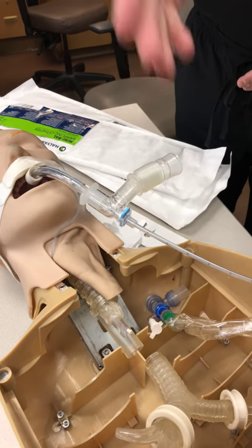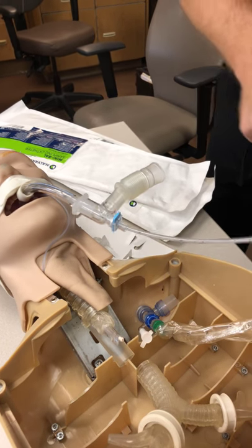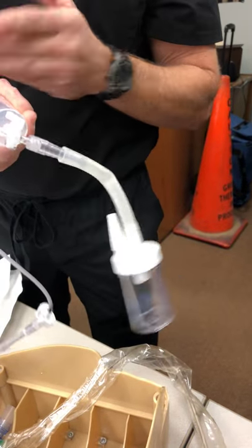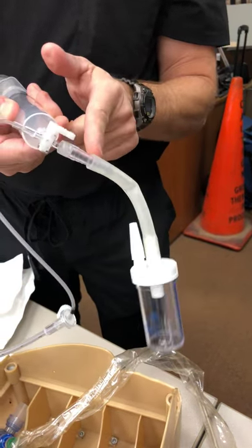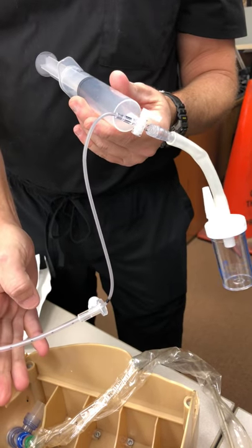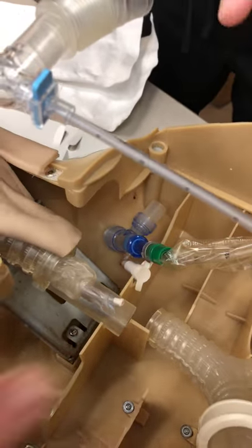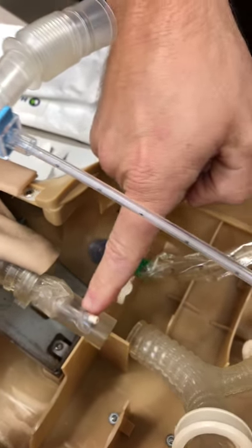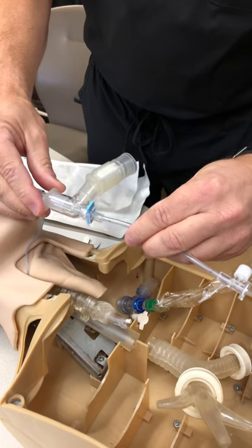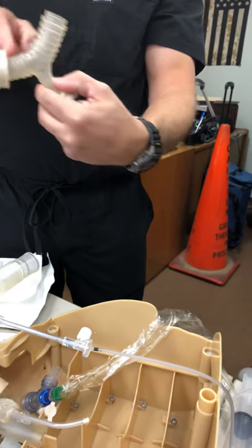Once I get it to that point, the next thing I'm going to want to do is take our syringe and connect it to our stopcock. Whichever way the stopcock is in the off position — so I want it closed — I'm going to give it five cc's just to clear the tip of that catheter, removing any debris that collected on the tip of the mini-BAL as I inserted it. Once I get it to that point, the next thing I'm going to want to do is advance that catheter another three to five centimeters to get us past the carina, into the right or left branch.